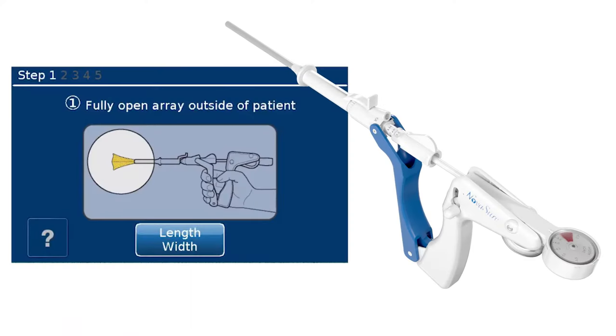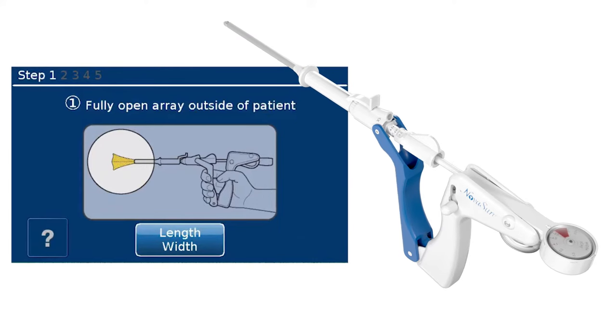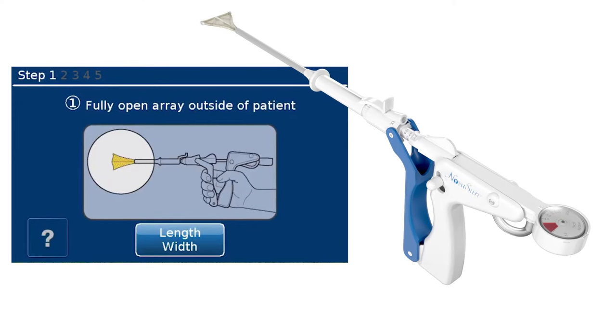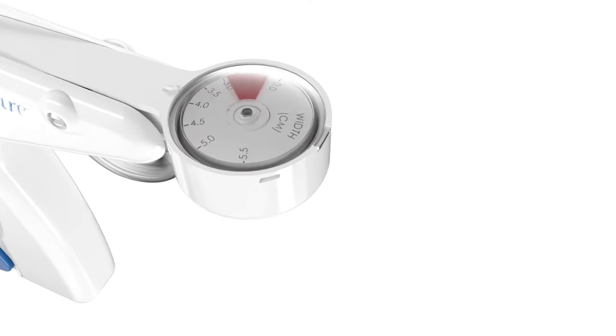Before entering the uterine length into the control unit, check the NovaSure device outside of the patient by deploying the array. Squeeze the device handles together to ensure the NovaSure device fully opens and the array position light in the lower right corner of the screen disappears when the device is deployed and reappears when the device is closed.